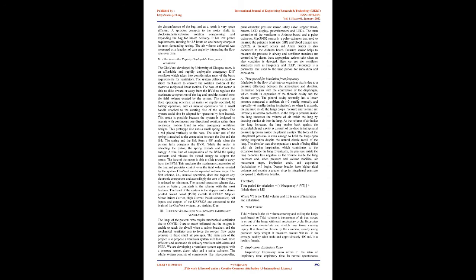The prototype also features an assist control mode and an alarm to indicate overpressurization of the system. Through this prototype, the strategy of cam-actuated BVM compression is proven to be a viable option to achieve low-cost, low-power portable ventilator technology that provides essential ventilator features at a fraction of the cost of existing technology.